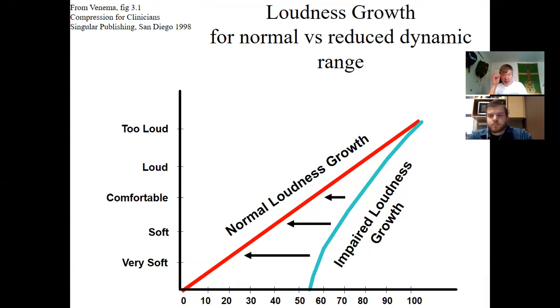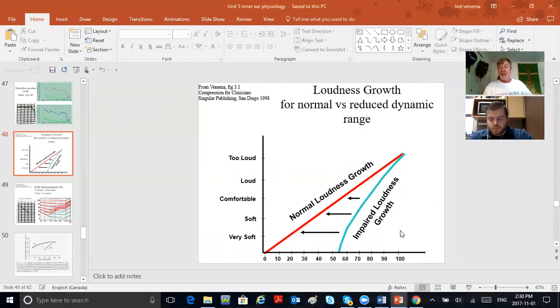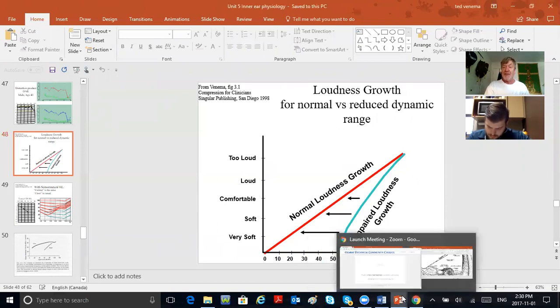Why? Because of outer hair cells. And because outer hair cells amplify soft sounds by the most, guess what? The hearing aids use wide dynamic range compression to imitate the outer hair cells. How? By amplifying soft sounds by a lot and loud sounds by little or nothing at all. That, in all essence, is the shape of physiology of the inner ear. It really is quite something.